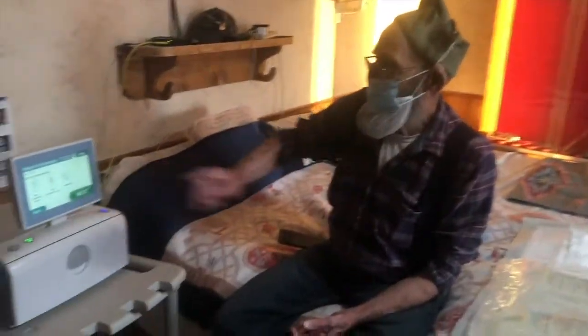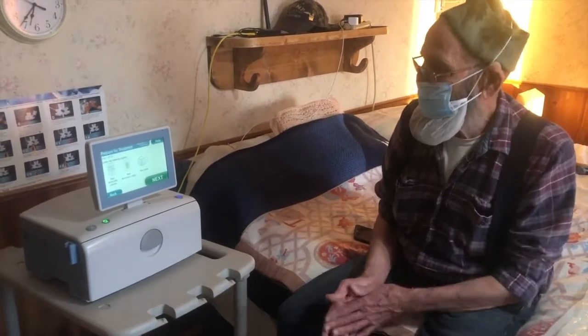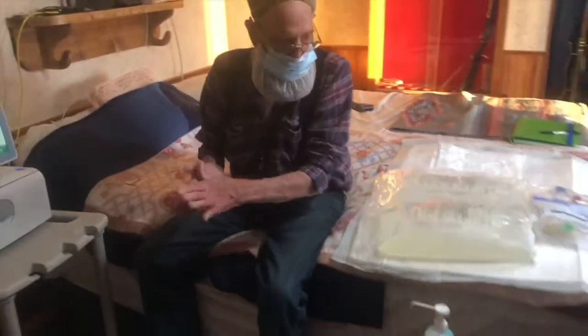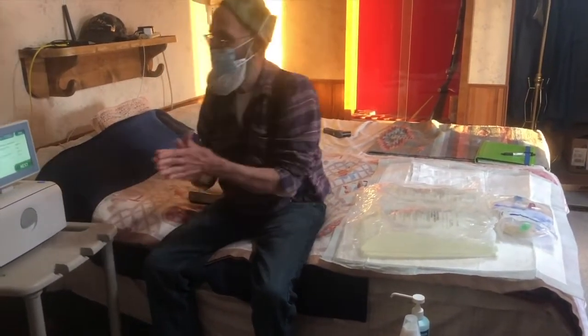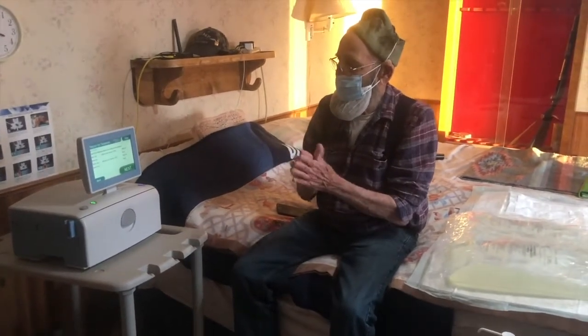Then my mask, I got a new mask on, and we got new disconnect caps. Everything's here that we need to do this transfer with. And you can use a little bit of this hand sanitizer to keep things moving right along. Gather your treatment solutions according to your program.